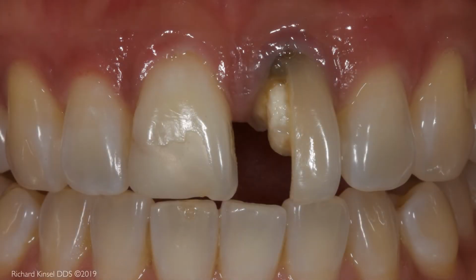This patient fractured her existing porcelain crown. The tooth had previous root canal therapy. Note the darkness at the gum tissue. The tooth on the left has a large composite filling that will be replaced with a partial porcelain bonded veneer.